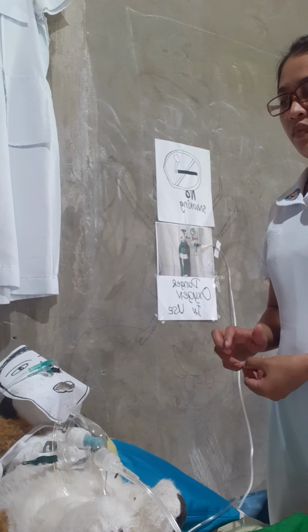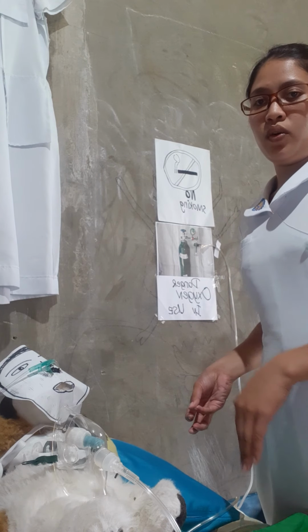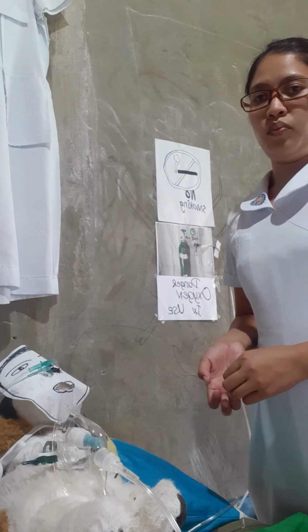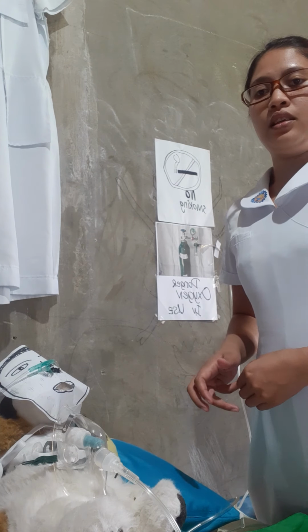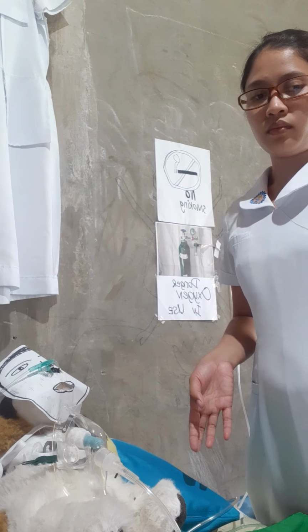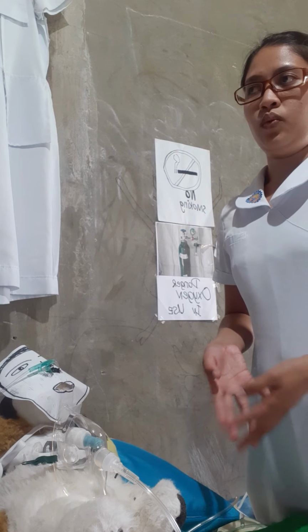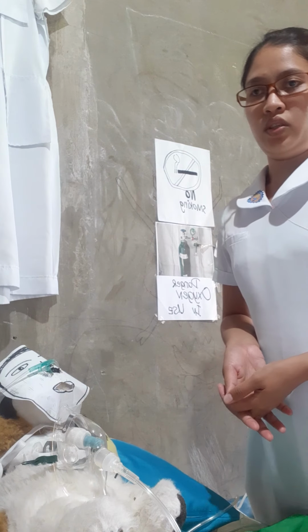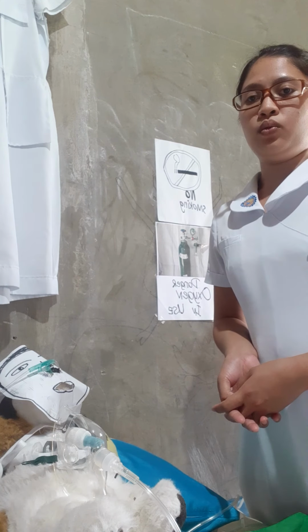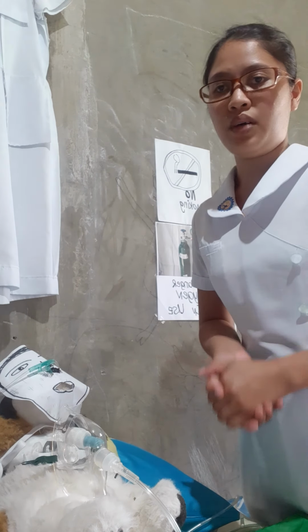Next, place the bed table closer to my working area with the equipment on top. Next, the trash receptacle should be within reach of my working area so that we can save time and effort during the procedure. Then for implementation, we need to put on face shield, goggles, and mask.